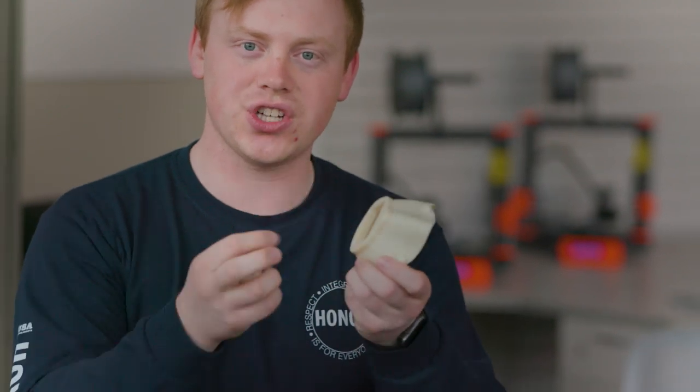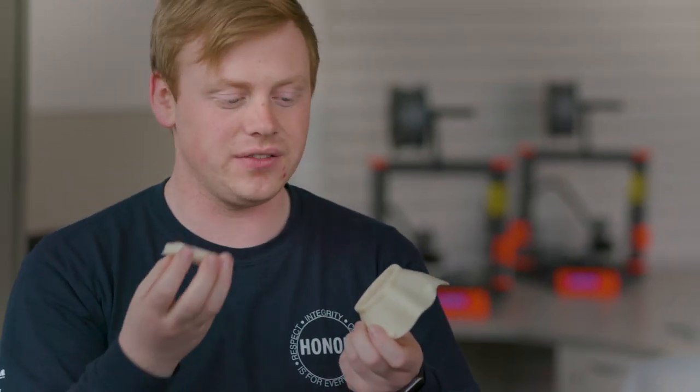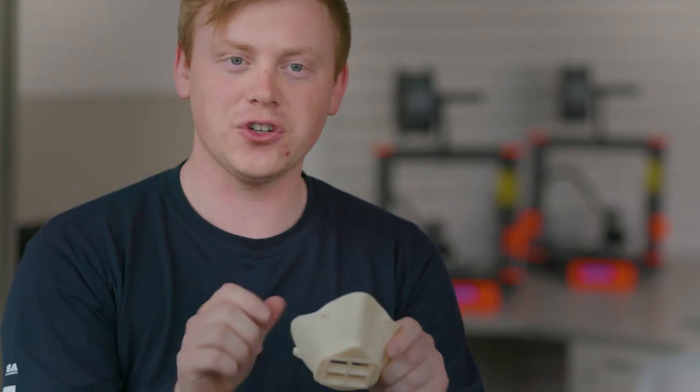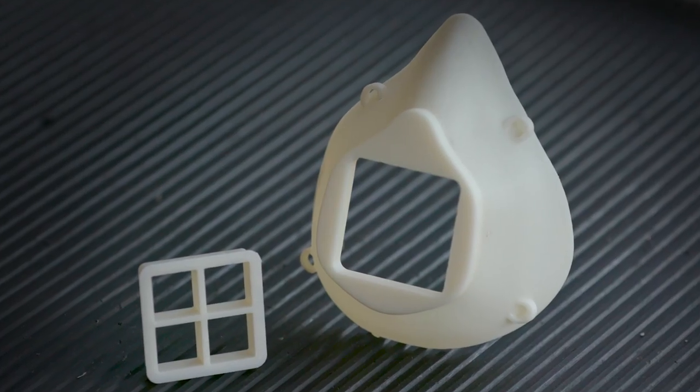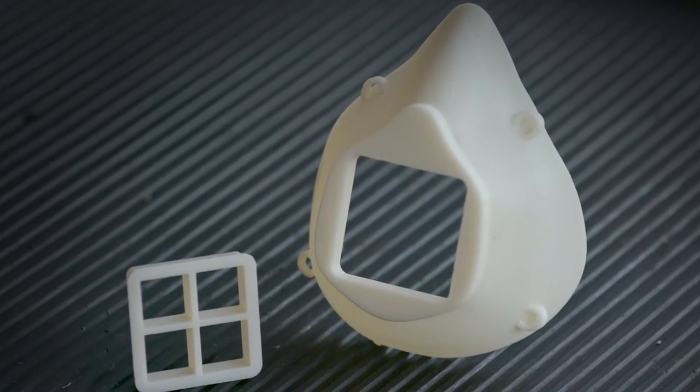You would take a small chunk of N95 rated filter mask and you would place it here and it would go in there like that. Then the first responder can reuse this piece and therefore we will go through less N95 material by only needing a square this size, and because it fits to their face it works really well for reuse.